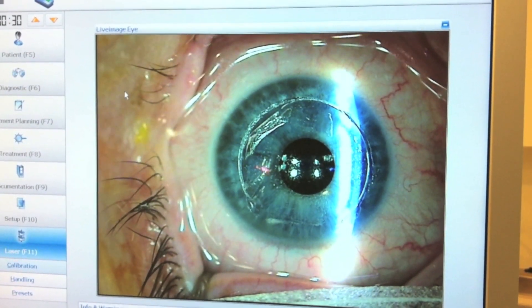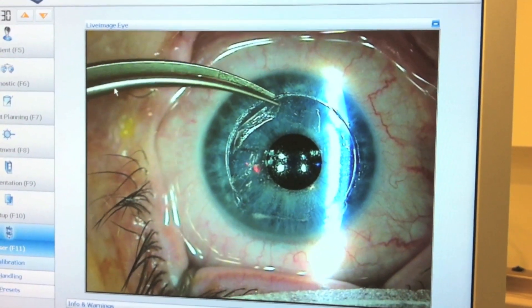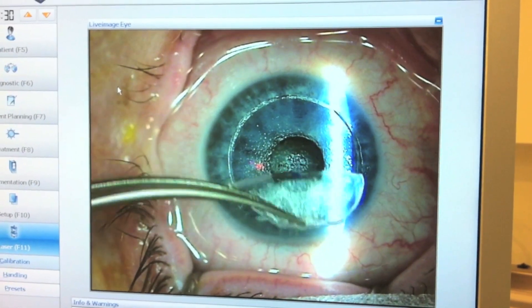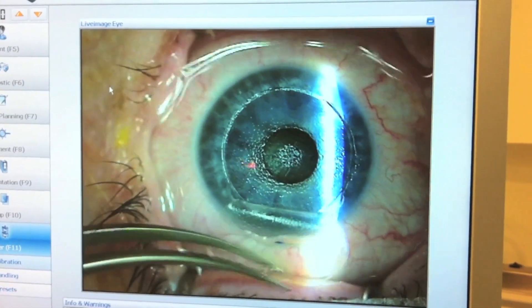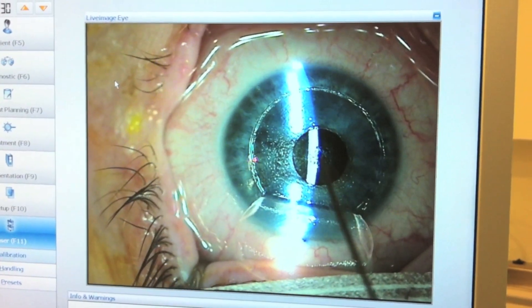Grasp the flap edge inferiorly with the forceps and bring the flap back quite forcefully and with an acute angle formed between the detached flap and cornea. This encourages the inlay to detach from the flap and remain on the stroma as the flap comes free over it.